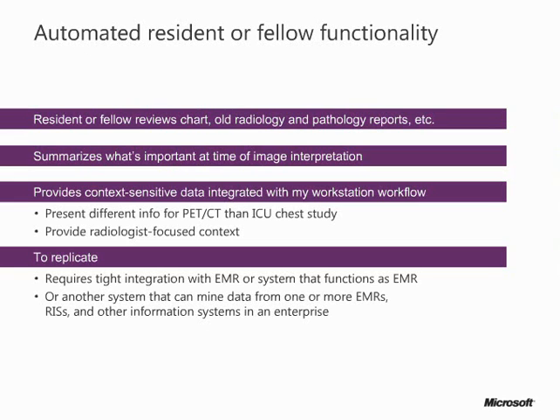And so in order to be able to achieve that level of information, I don't really have the information I need just from my PACS system. I don't have it on my speech recognition system. I don't have that information just on my electronic medical record, but I need to have all those systems be able to intercommunicate, and I need to have a mechanism where all those pieces of information from those different systems can all be put together for me to be able to evaluate.